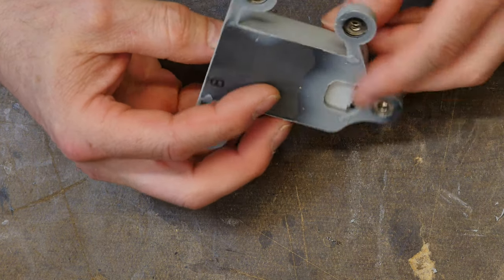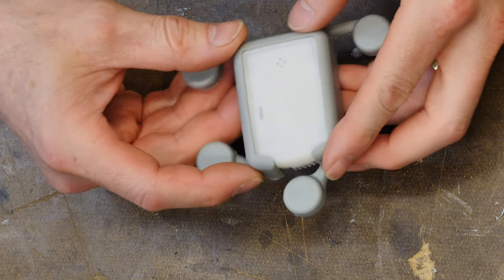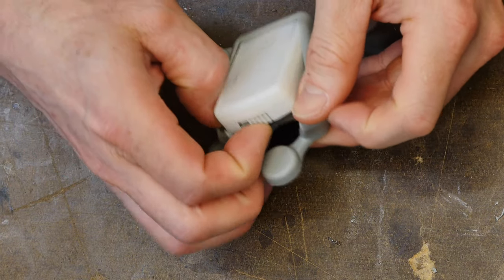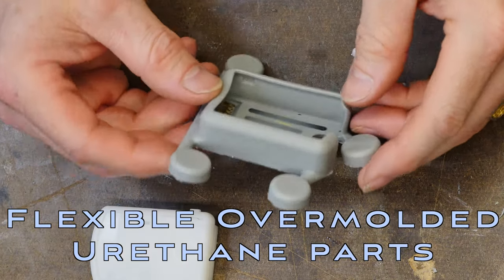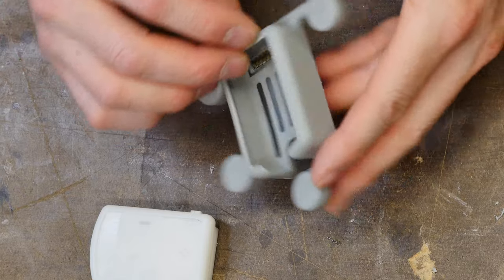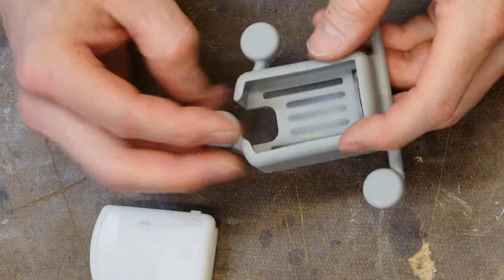Have you ever wondered how you make flexible urethane resin parts? I'm going to show you how I make some flexible overmolded medical parts — yep, there's electronics inside that thing — and I'm going to show you how it's done.